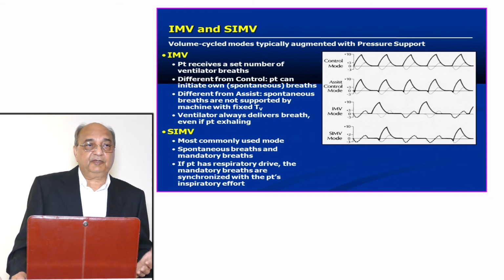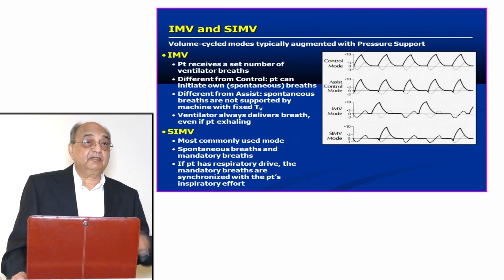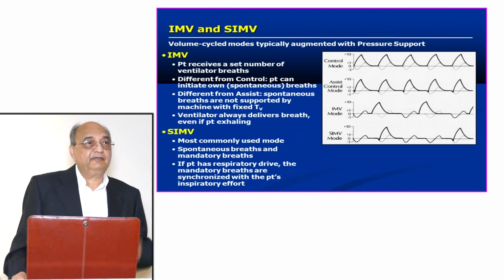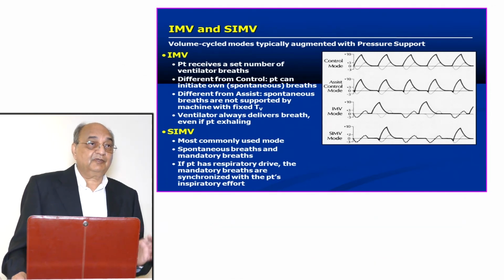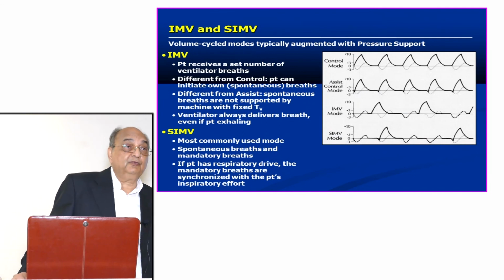So this is how it mostly proceeds. But in some patients, it's very easy to put the patient on a ventilator because it is our decision. And when the patient is taken off the ventilator, it is the patient's decision. The patient will take over itself and come out of the ventilator itself. So it's very difficult to wean the patient off the ventilator. It's very easy to put the patient on the ventilator. So it might take hours, days, or even months to wean the patient off.